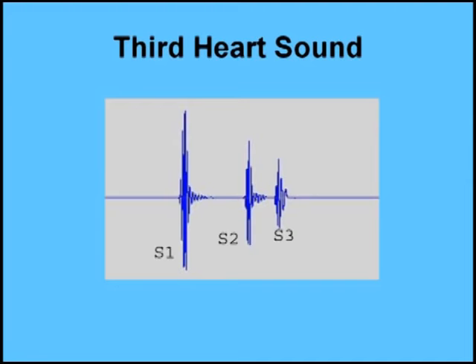The third heart sound occurs in early diastole, shortly after the second heart sound, as shown by this phonocardiogram. Listen to a patient with the third heart sound. I will begin with 3 normal beats and then add the third heart sound.